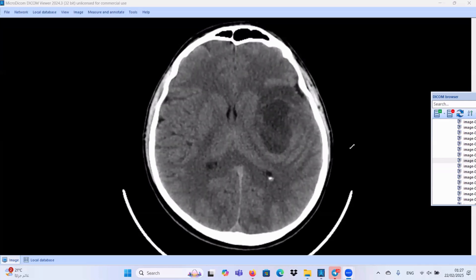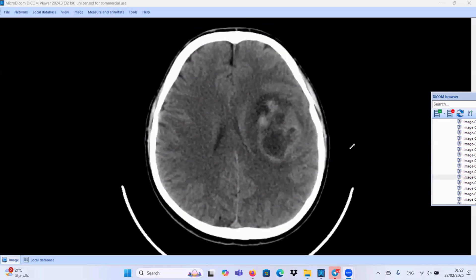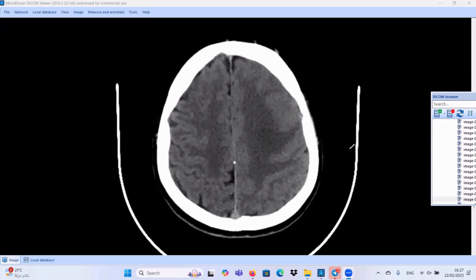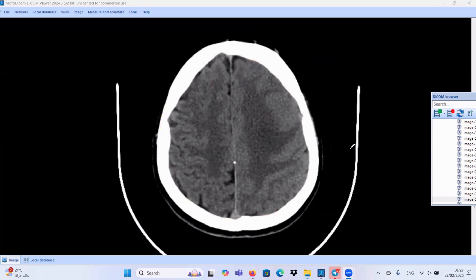As usual, we should measure the midline shift, as we did many times before, from the foramen of Monroe towards the midline. Also, it exerts mass effect in the form of effacement of the cortical sulci. Look for this effaced, swollen cortical sulci as compared to the normal contralateral side.